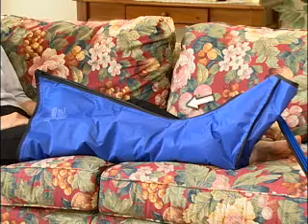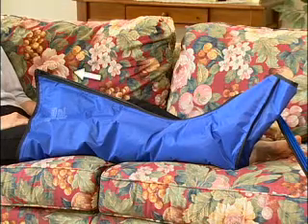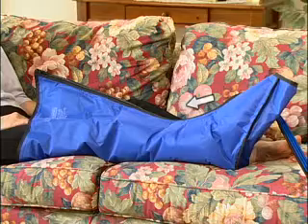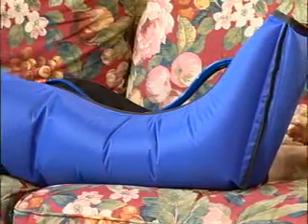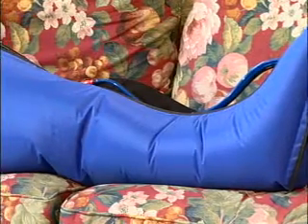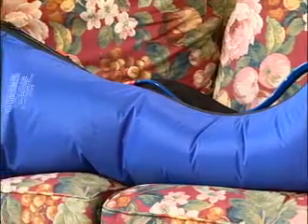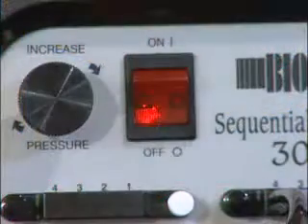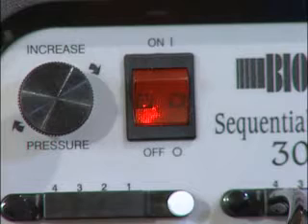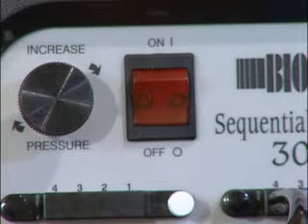The sleeve will begin to inflate, first around the hand or foot. The sleeve contains 4 pressure chambers, which will inflate in sequence, moving slowly up the arm or leg. As each chamber inflates, the pressure in the chamber will be slightly less than in the previous chamber. The chambers then simultaneously deflate, and the process begins again. Note that the on-off switch may stay lit after you have turned off your unit. This is normal, as the unit's built-in timer will adjust to be ready for the start of your next treatment. Once the automatic adjustment is completed, the light will shut off.